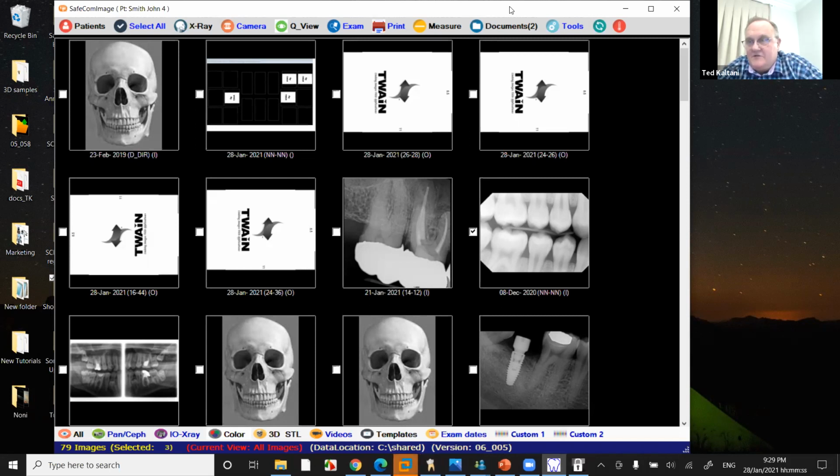So let's say if you have access to your email on your iPhone, the messages will come to that email exactly the way you see it in the operatories. So you'll say your next patient arrived, operatory 2 or whatever. So you can actually access or receive them on any device through that transfer service.